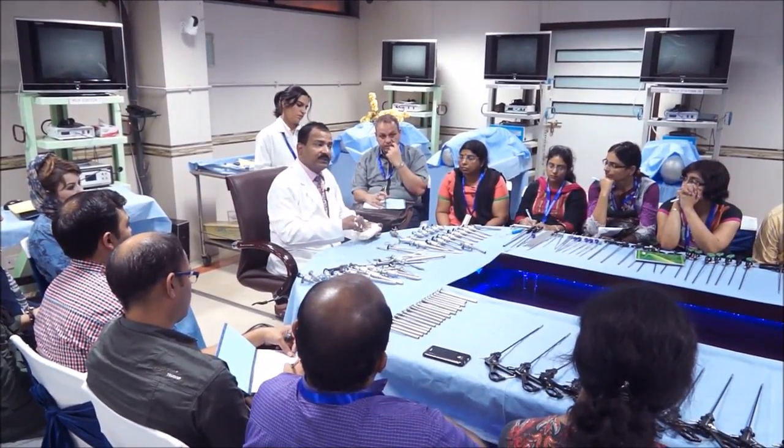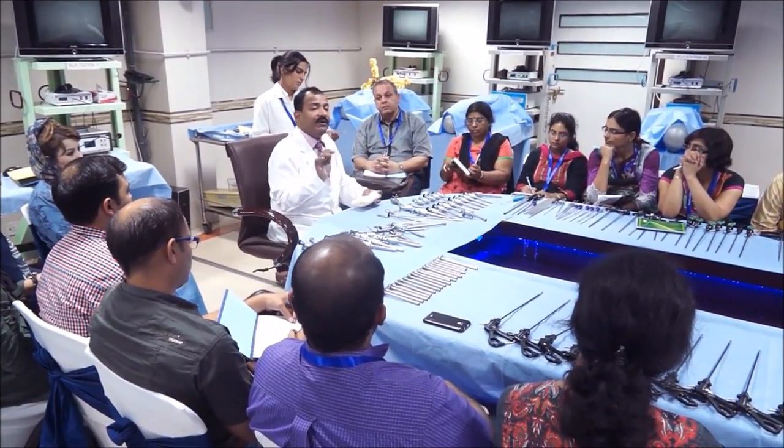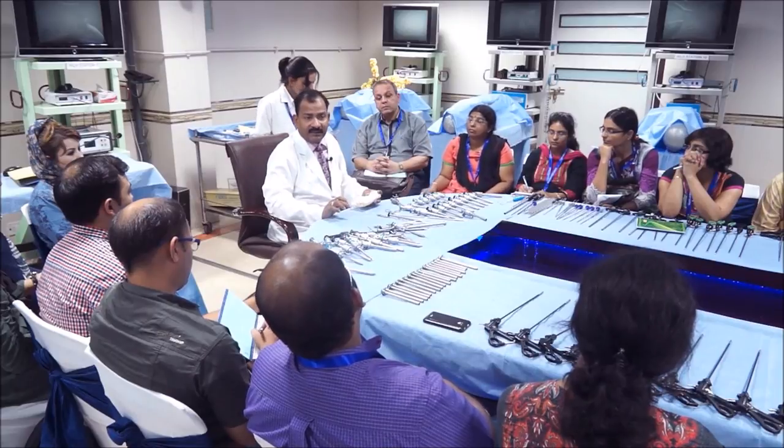But in those obese patients, you will never go oblique. Oblique you can go only when you are going around the umbilicus.